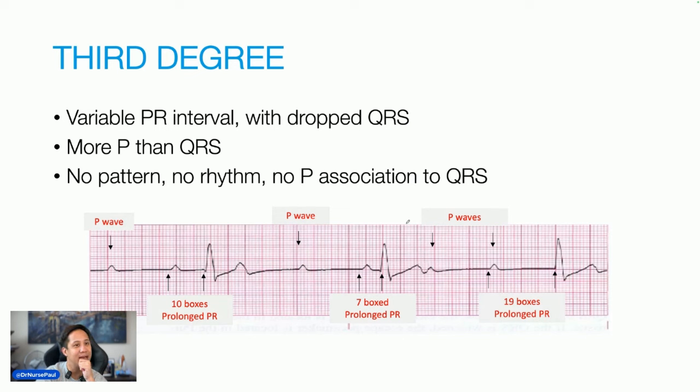Are there more P's than QRS on the screen? In your 6-second strip, are there more P than QRS? How many P waves did you see? If you guys are still asking me what a P wave is, my goodness, we've been talking about this for 4 hours. Somebody said there are 7 P waves. I'm not going to trust you. I'm going to count myself because I'm a nurse.